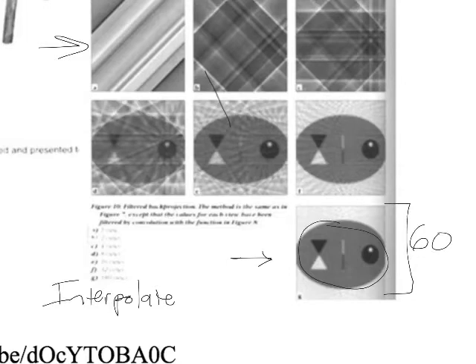The thing that's interesting too is it does this pixel by pixel, right? And we'll define pixel in a sec, but it assigns them an attenuation profile. So it says that this stuff that's black has a different density than the stuff that's white. So it's embedded in the image. It's not just the spatial representation of where things are.